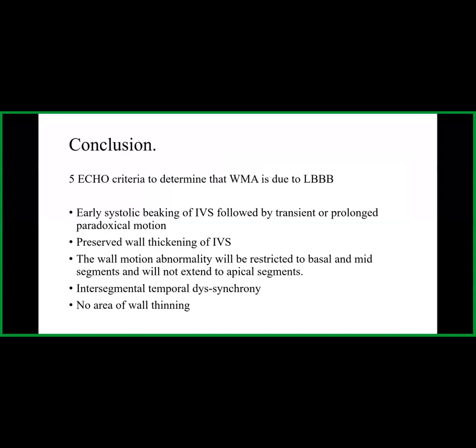And these are the 5 main criteria, as well as some other criteria, I'm sure, which will vary from sonographer to sonographer, but mainly these are the 5 echo criteria that we'll look at to try and diagnose left bundle branch block. And that concludes my presentation for this evening about left bundle branch block. Here you will find some of the references or suggested reading articles which will talk more about what I was explaining in this presentation today.